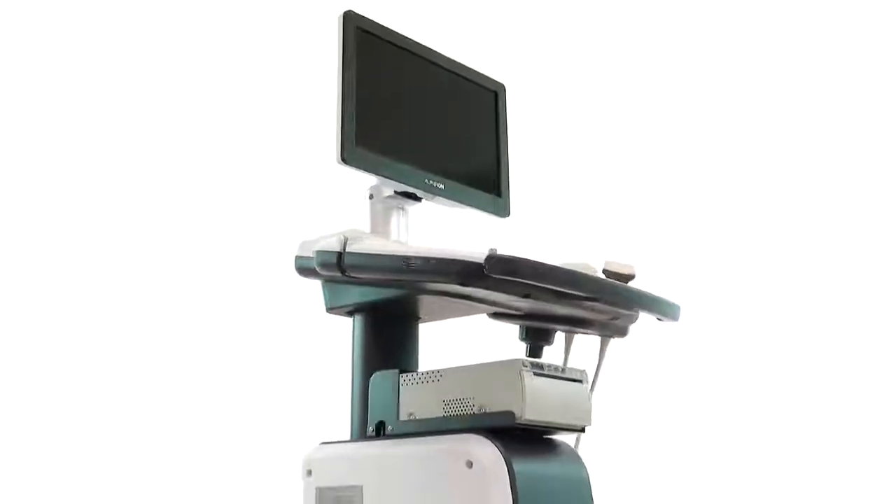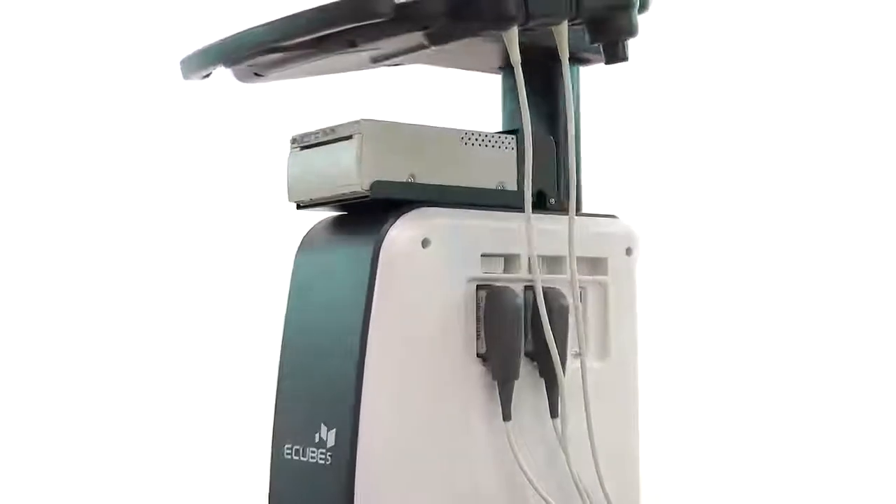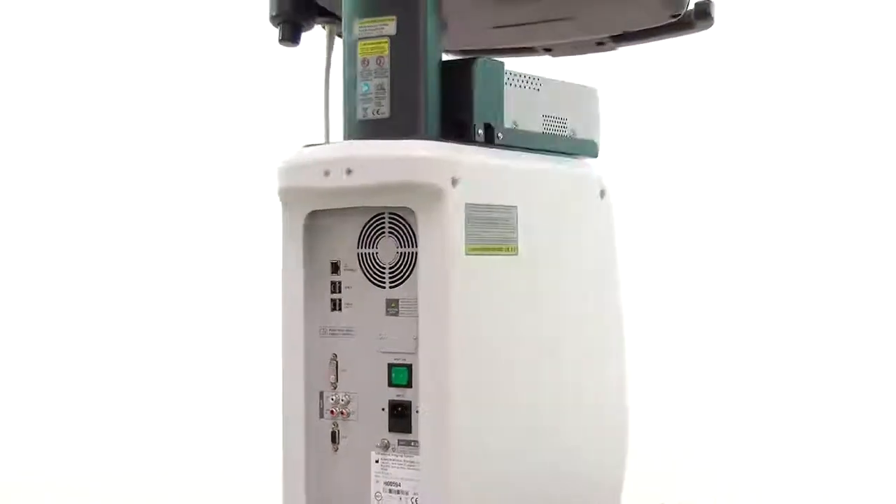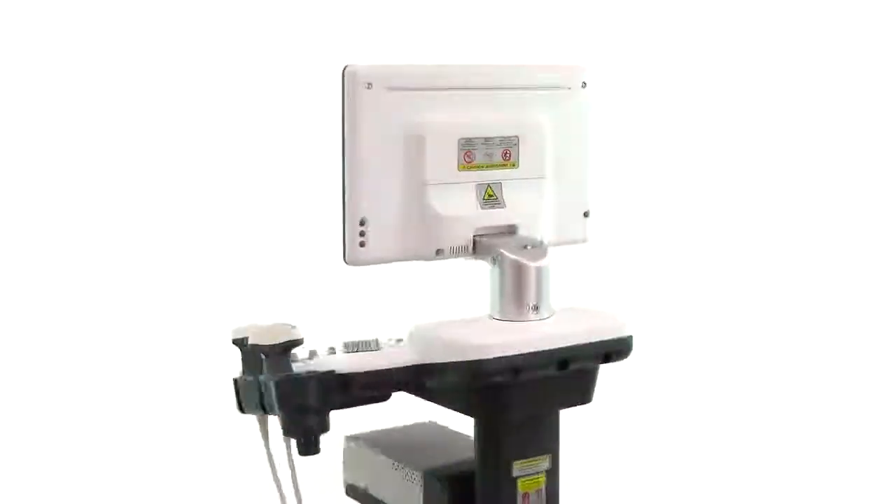The Alpinion E-Cube 5 is an entry-level console ultrasound system that's best at OBGYN, general imaging, small parts, MSK, and vascular applications.